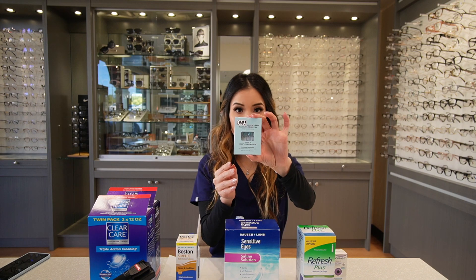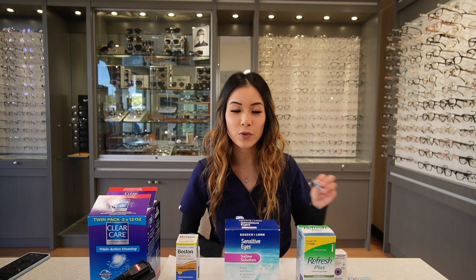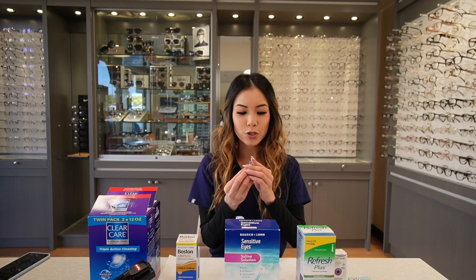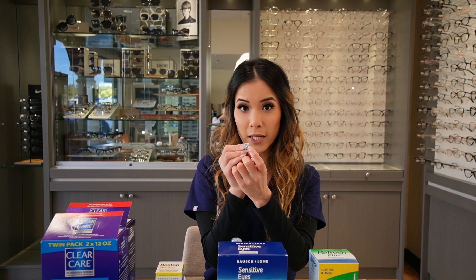Our last product is plungers — these are DMV plungers. These are used primarily to help children who have difficulty taking out their lenses, and this is guaranteed to take out your lenses. Be sure to use the ones that don't have the hole at the end of it.